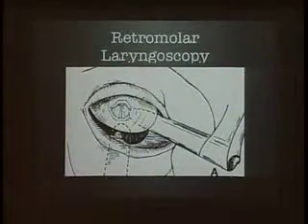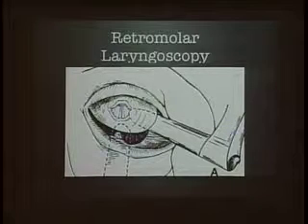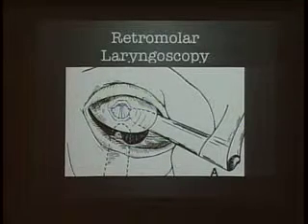I changed the label because for 15 years the residents who would go back to our university hospital would do this. They would get screamed at by the adult anesthesiologist, threatened to be kicked out of the system. But after a while, after I taught some of the adult anesthesia attendings there, if the anesthesia resident said, Dr. Borland said to do this, they actually let them try it. I call it the Borland bad laryngoscopy, but it really is a retromolar. So if you think of aiming for the right molar or the right tonsillar pillar with your straight blade, you cheat and you change a whole bunch of important characteristics.